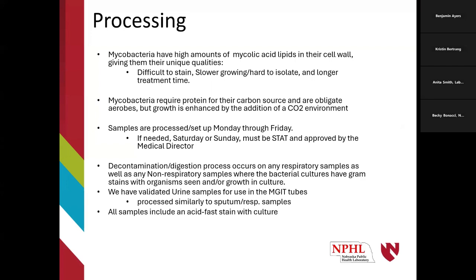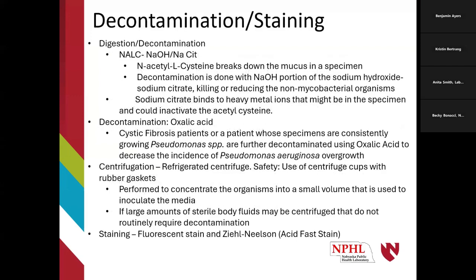We also have validated urine cultures for the use of our MGIT tubes, and I'm going to dive into the MGIT. Every culture does have an initial smear that goes with it, and that is usually reported out same day once we get it. So just briefly going over the digestion and decontamination.